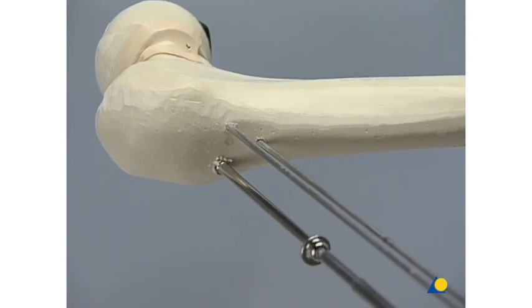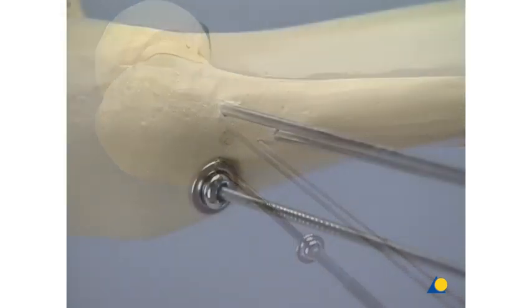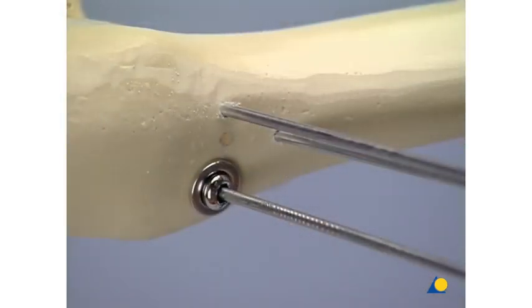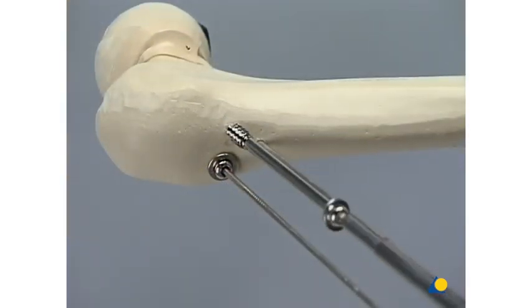The use of washers may prevent the screw head from sinking in. The two remaining screws are inserted accordingly and the guide wires are carefully removed.